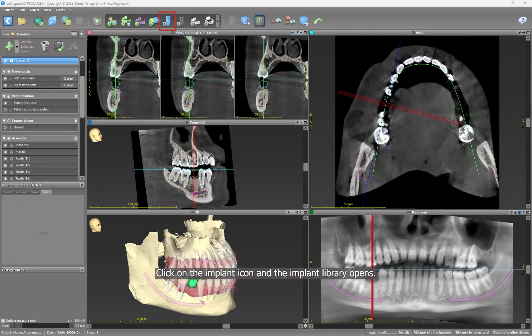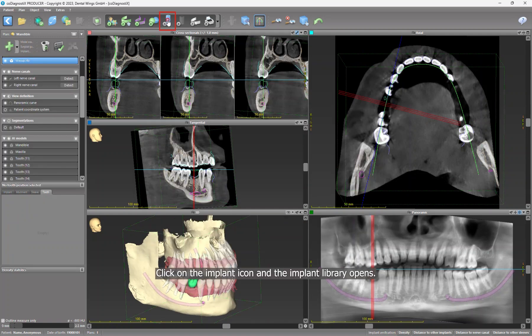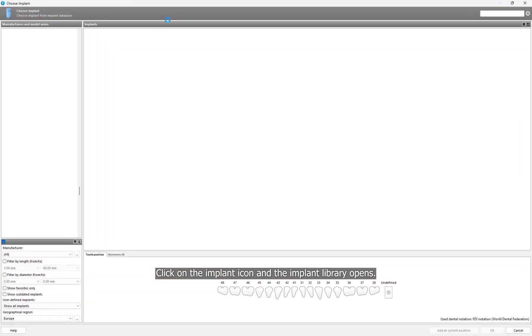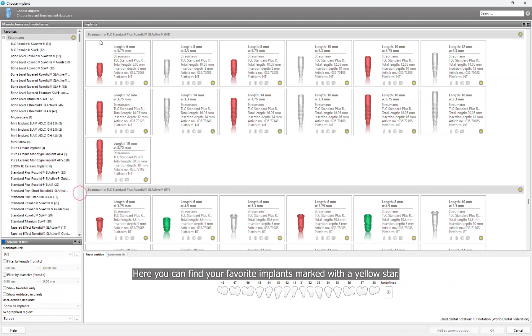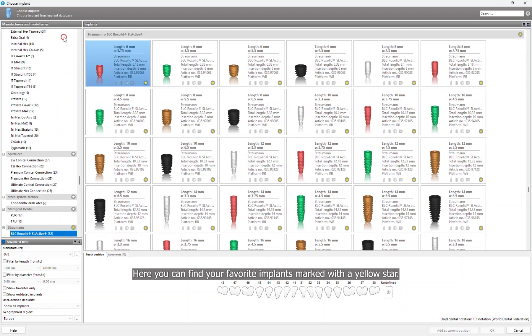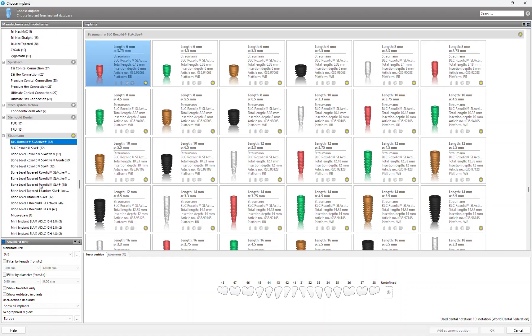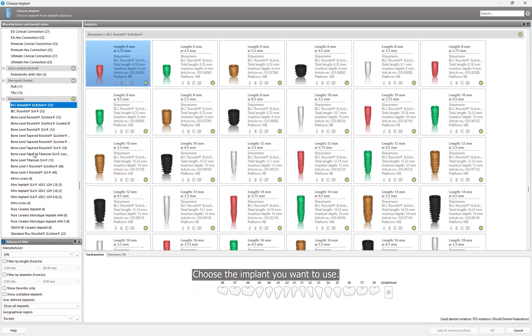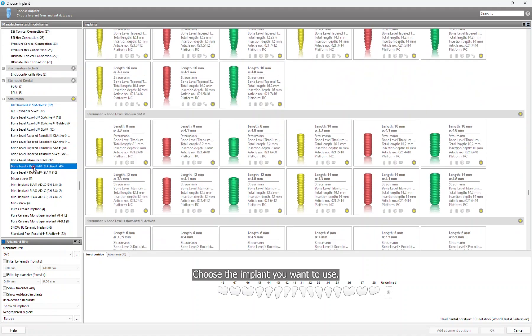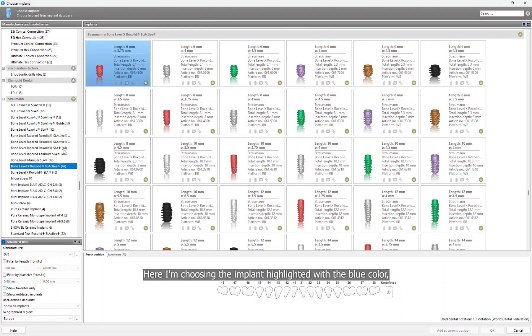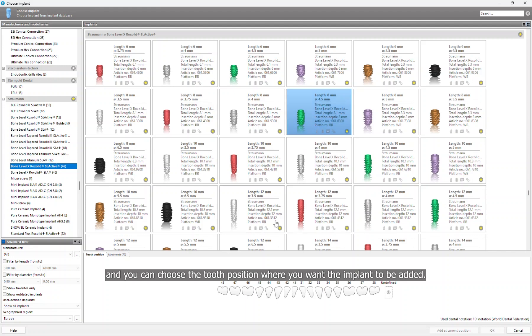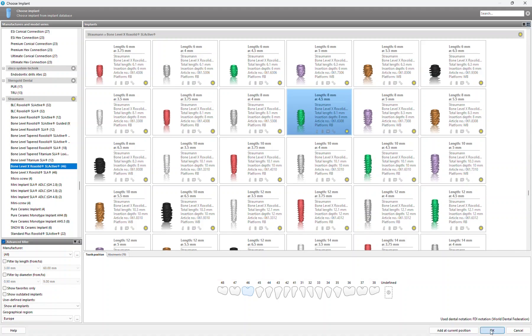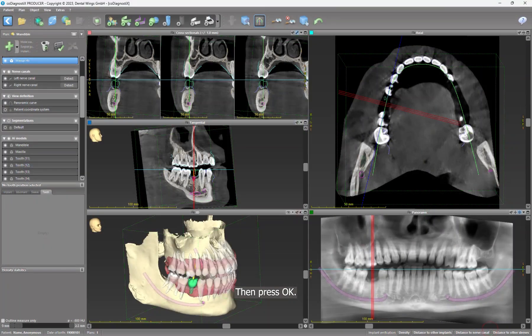Click on the Implant icon and the implant library opens. Here you can find your favorite implants marked with a yellow star. Choose the implant you want to use. Here I'm choosing the implant highlighted with the blue color. And you can choose the tooth position where you want the implant to be added, then press OK.